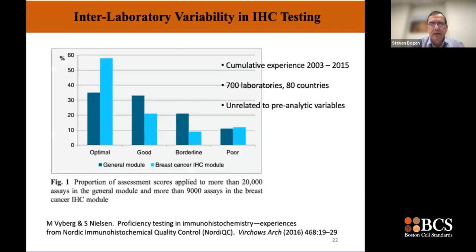There is actually a rich literature describing the difficulties experienced by IHC laboratories in the absence of calibration. These summary data from one of the leading European proficiency testing programs summarize the performance of participating labs over more than a decade. The data, in my opinion, are especially impressive because the program incorporates central review of the participating lab slides.